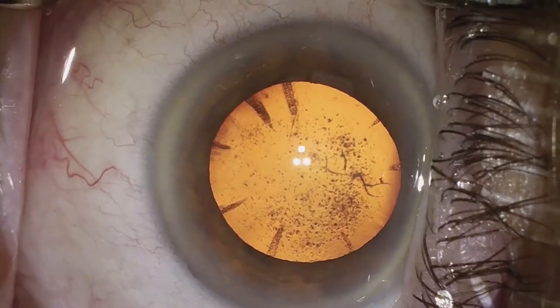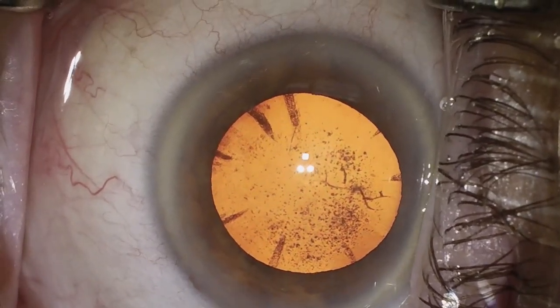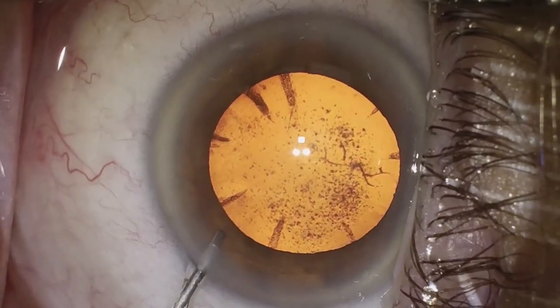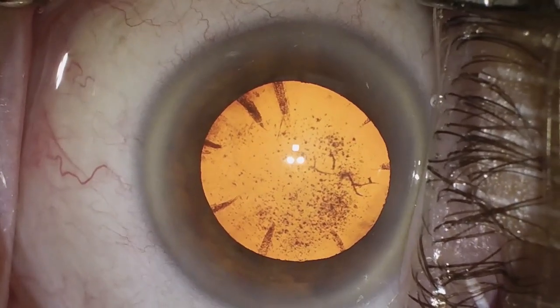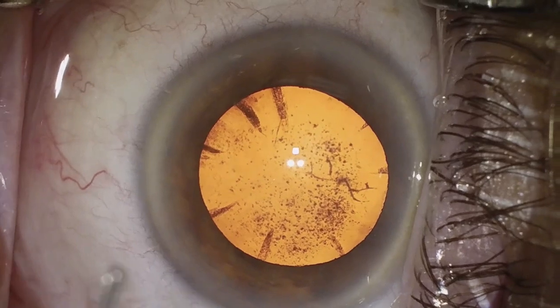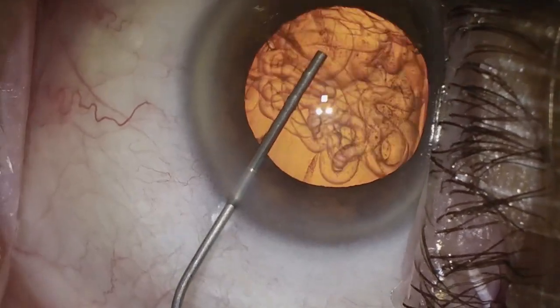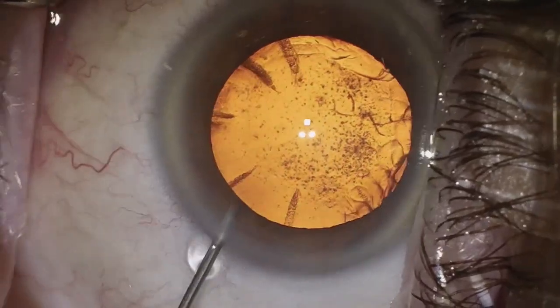This patient has lattice corneal dystrophy, which can, of course, affect the vision, and it can also affect your view during cataract surgery. Thankfully, in this patient, the condition was not severe and still allowed me to perform the cataract surgery really without much of an issue.